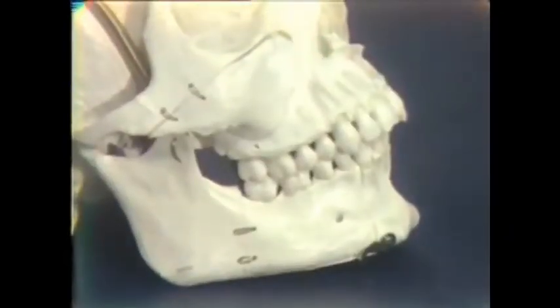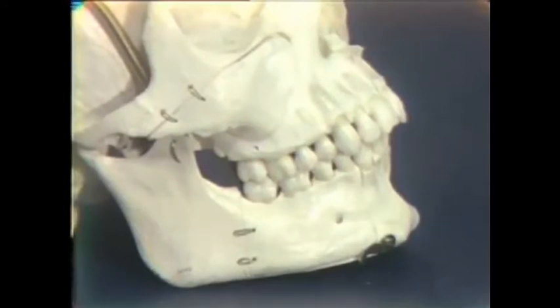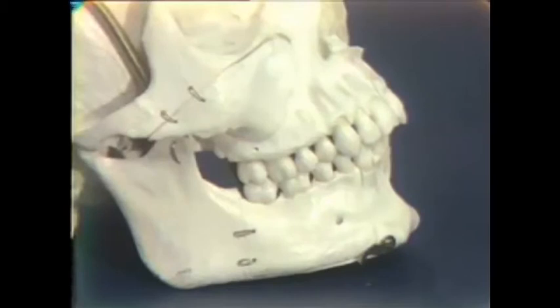All right, we'll demonstrate buccal infiltration of the maxillary first molar. And let's recall in so doing that we'll be anesthetizing both the terminal branches of the posterior superior alveolar nerve and the middle superior alveolar nerve, which anesthetizes the mesiobuccal root of the first molar. And this anesthetizes first molar and adjacent bone and overlying alveolar soft tissues.